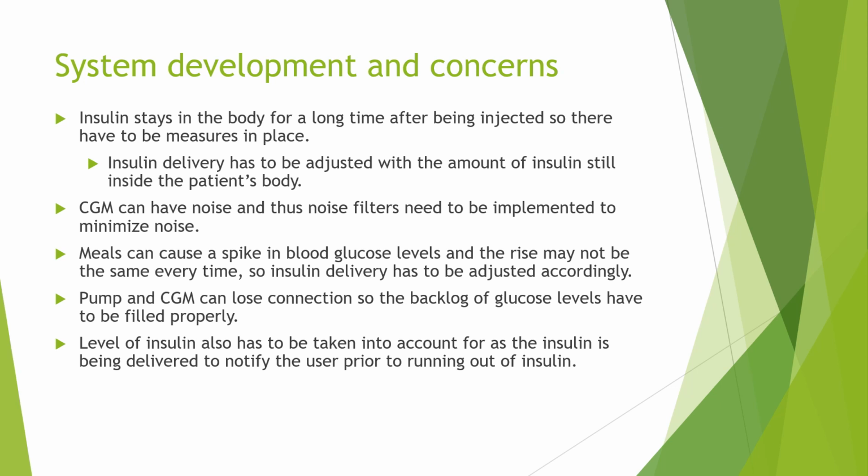The pump and CGM can lose connection, since that can happen especially with Bluetooth ones. There's typically a safety mechanism for those to make sure that the insulin isn't over or under delivered. As well, because the insulin pump itself has a reservoir of insulin, we should take into account how much insulin is left, and we should have a system to notify the user before the pump runs out of insulin.